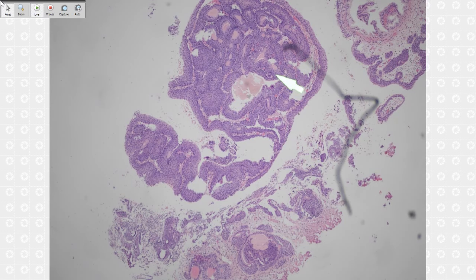If beyond the lamina propria, be careful, because there is another differential. I always think about urothelial carcinoma with inverted growth pattern. That usually shows cytological atypia and mitosis. But this one looks really well circumscribed, with just a broad base, right?